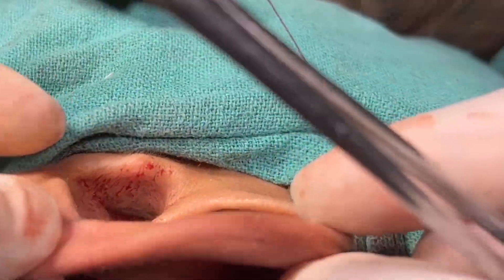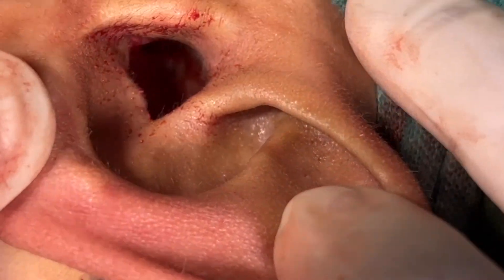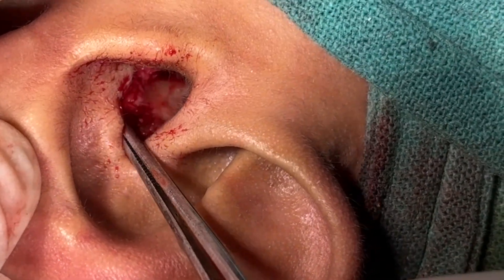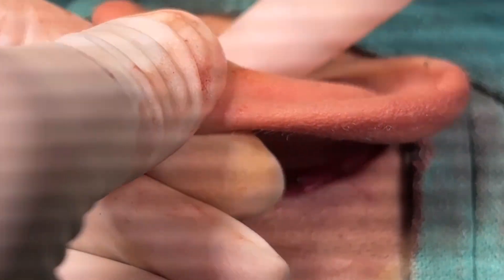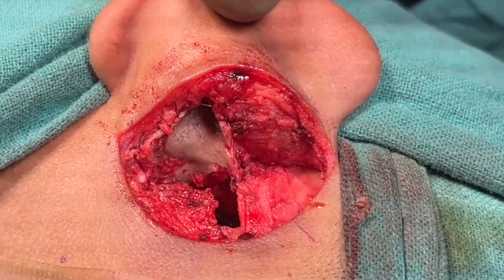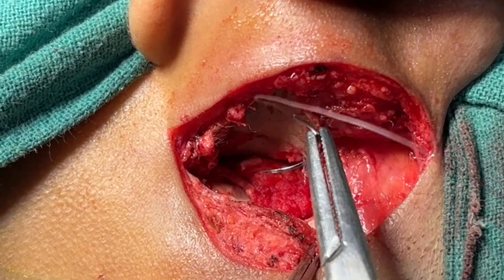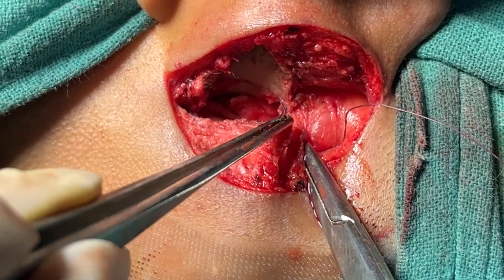The meatoplasty is now complete. You can check that the size of the meatus is sufficiently open, and the shape of the new meatus should be circular once there is a nice ear packing after surgery — this can be done with gel foam, umbilical tapes, or antibiotic dressing. The post-auricular muscles are being exposed to the new meatus, and the suturing should be done such that the muscle is not exposed into the external auditory canal or the meatus; the post-auricular muscular flap should be sutured a bit more posteriorly.